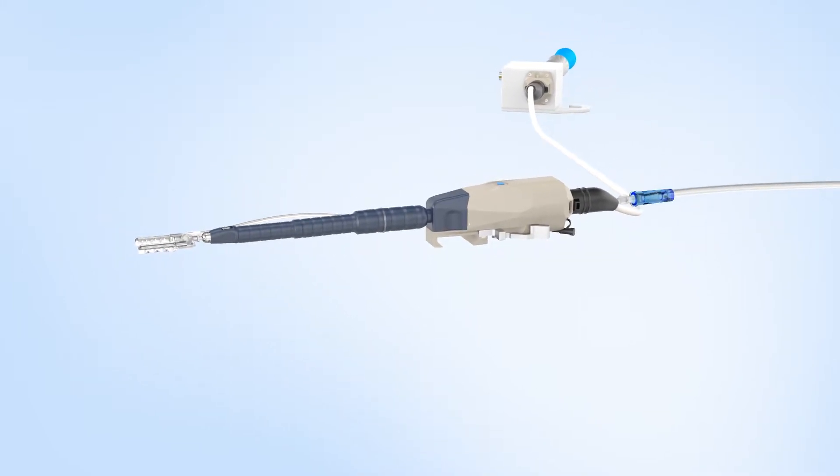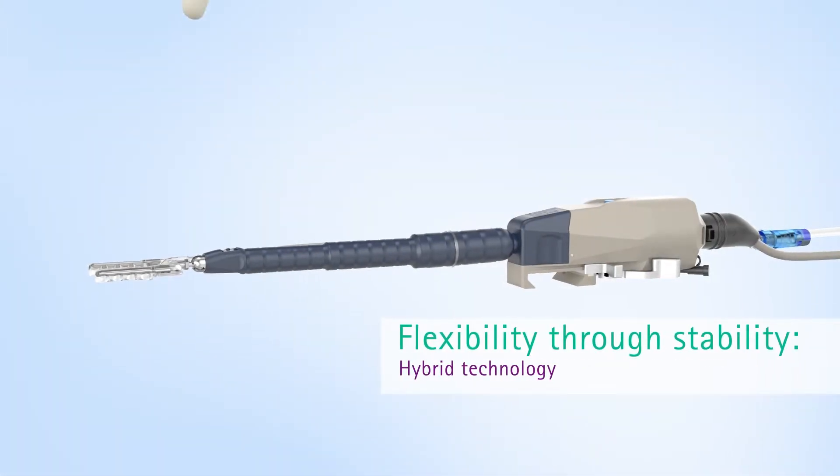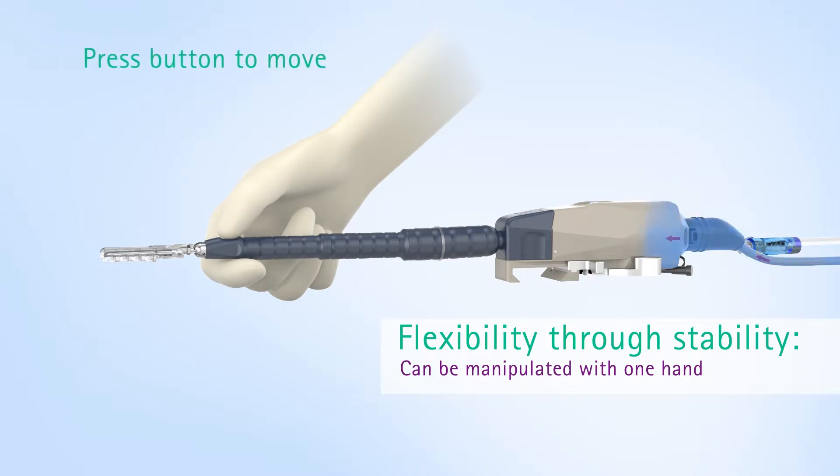Once everything is connected, the FlexHeart single-use stabilizer can be plugged in. Finally, connect the vacuum tube and the device is ready to use. The hybrid technology allows the working tip to be manipulated to the desired position with one hand without turning and adjusting the knob.